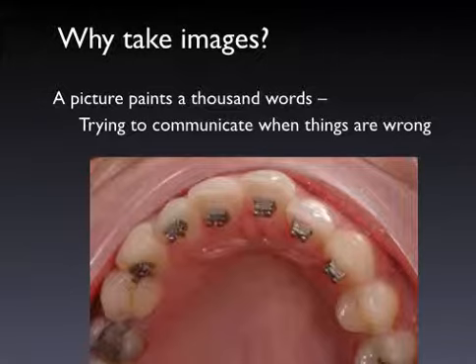Now, he was adamant they were in the correct position, but it's obvious to see the heights are all different. And as we found out, he'd actually only got the torque angulation device. So we had to explain to him why you needed both bits of equipment and the photograph to help highlight the problems and why you should buy the equipment.